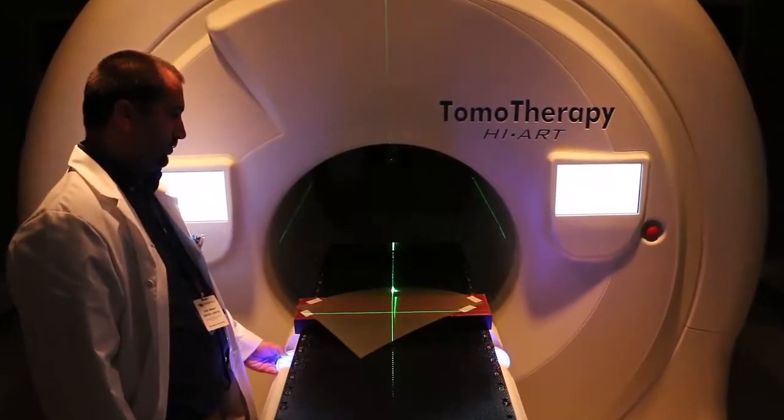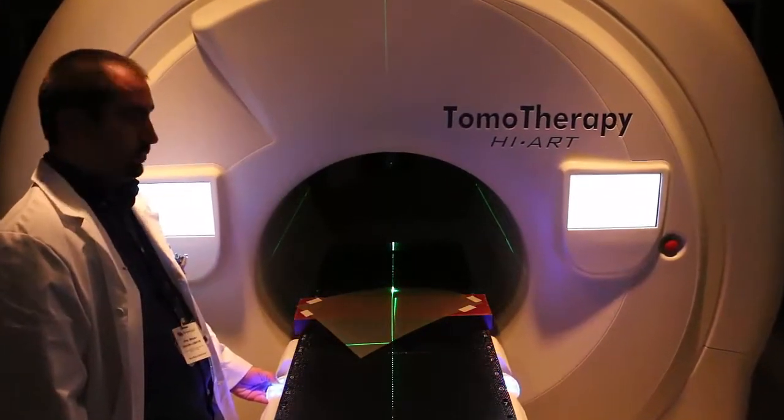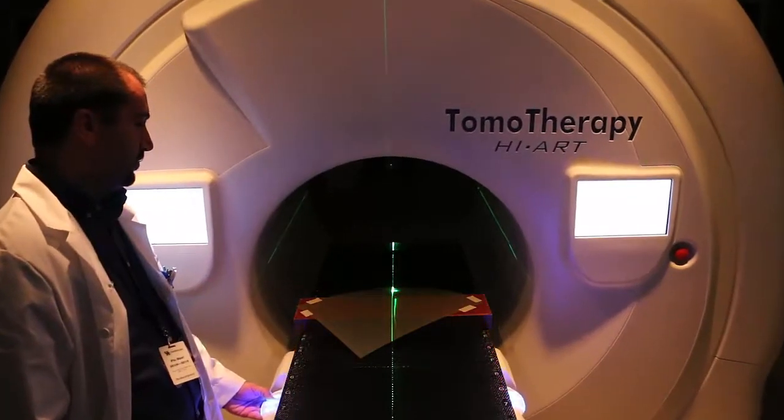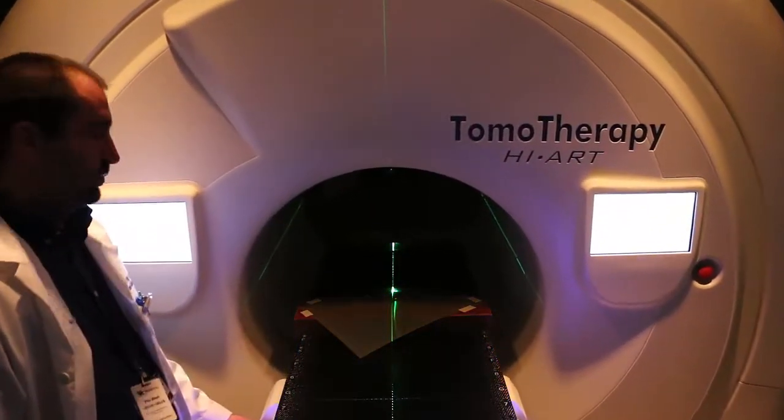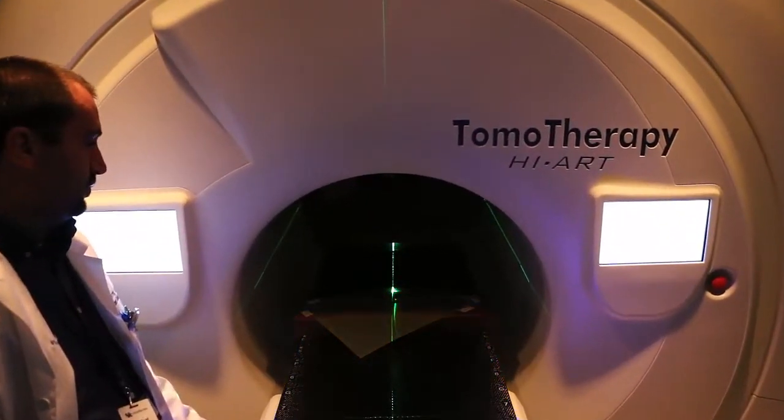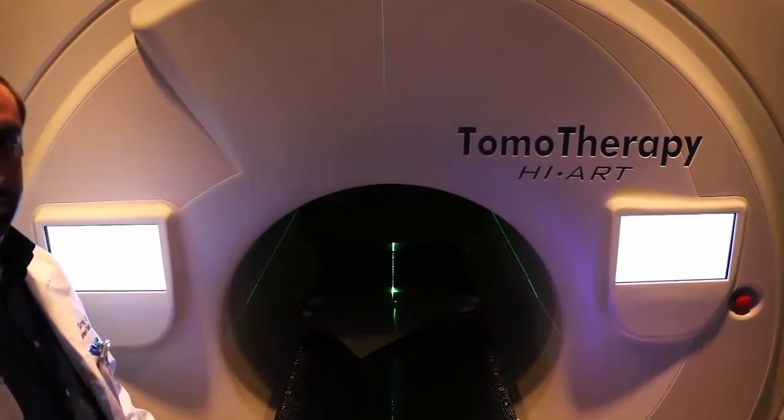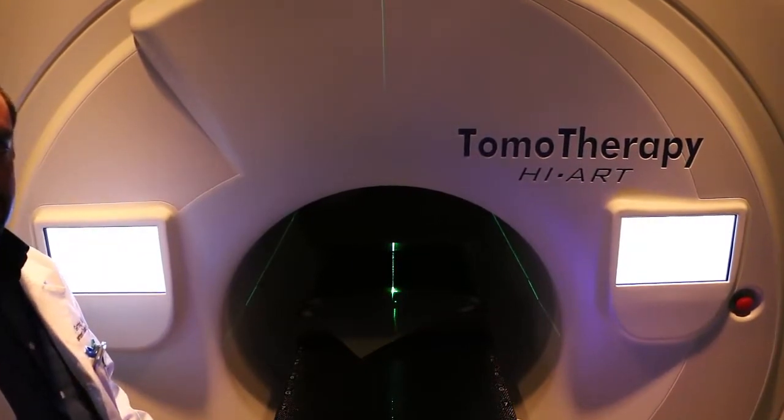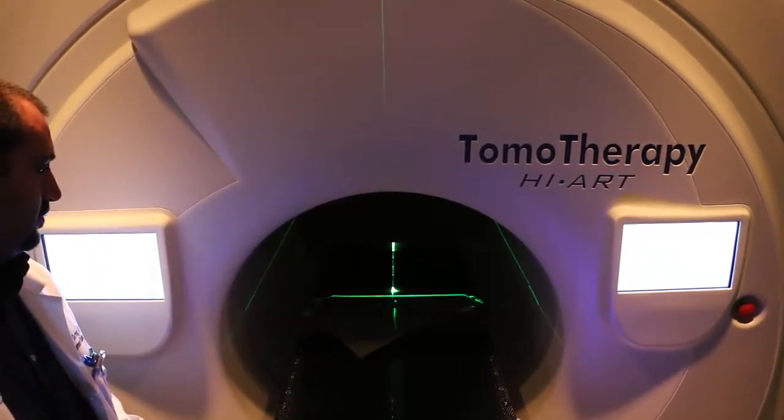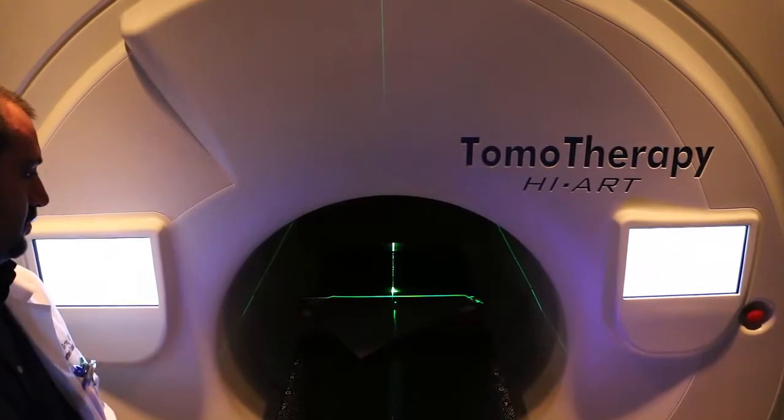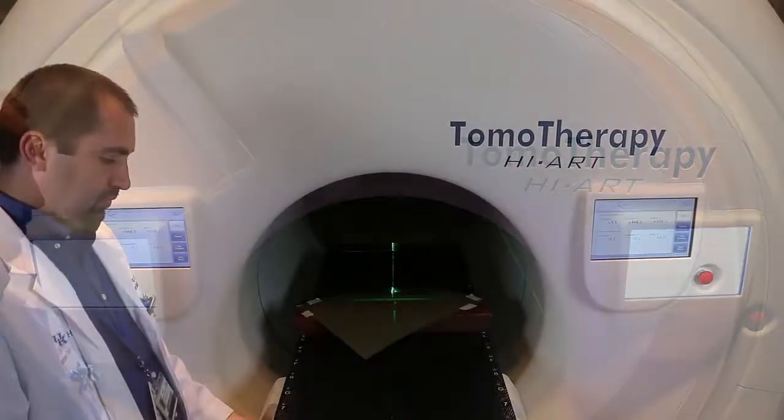The next thing we want to do is position the film in the Z dimension. So we do that by moving the phantom into the bore to account for couch sag and then adjusting the height of the couch until the green laser is skimming just across the surface of the film.